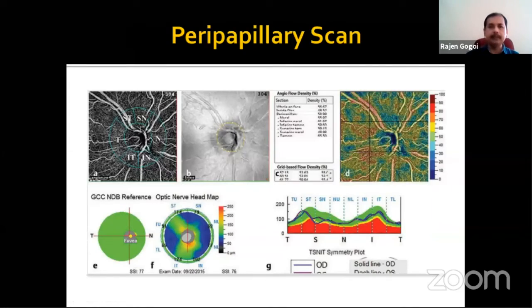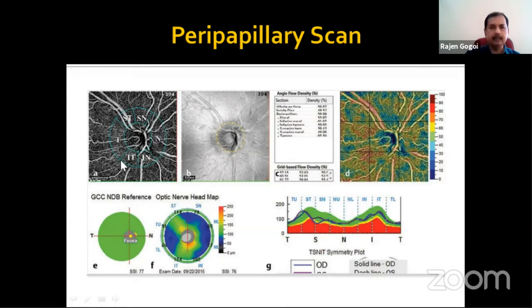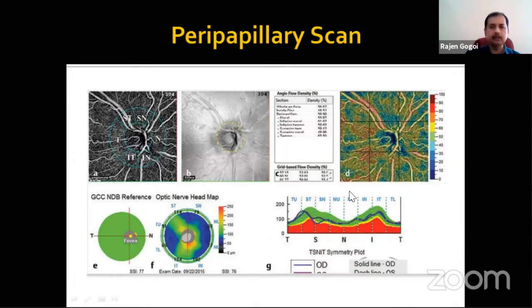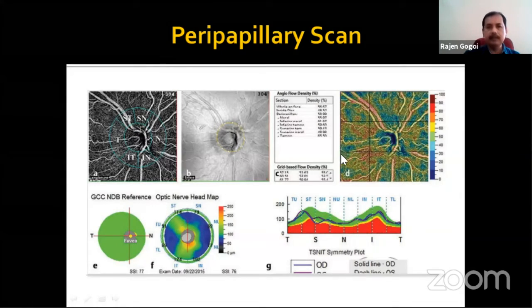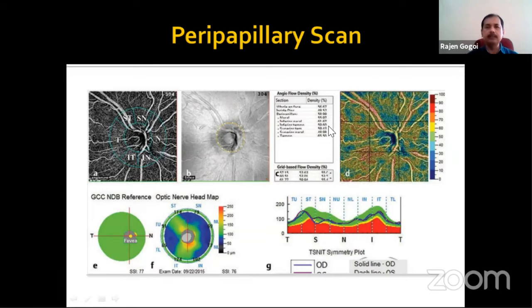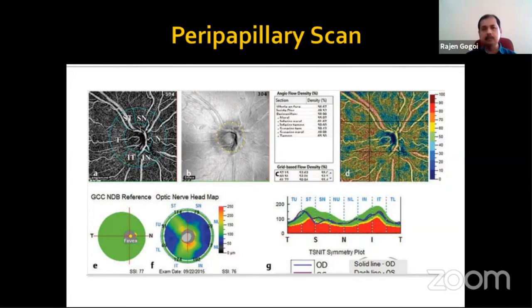In the peripapillary scan, we get six sectors: superior temporal, superior nasal, temporal, nasal, inferior temporal, and inferior nasal. In these six sectors, vessel density is calculated and the density percent is given. In normal cases, 55 to 65 percent density is what we get, and usually the temporal sector shows the highest density. Similar to the TSNIT curve in OCT, we can get the same representation in the peripapillary scan as well.